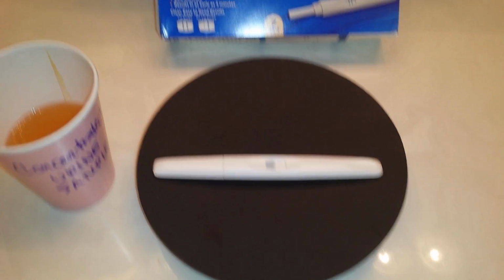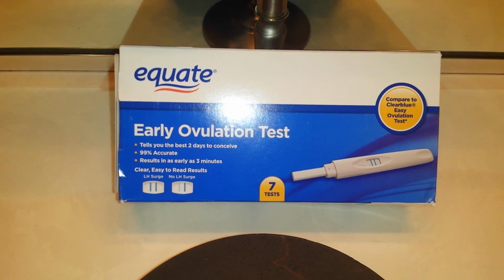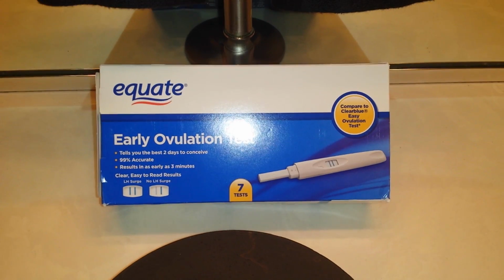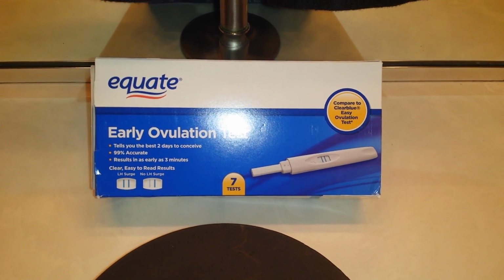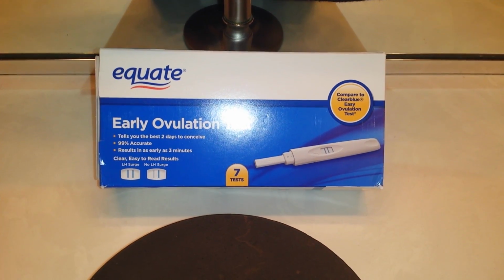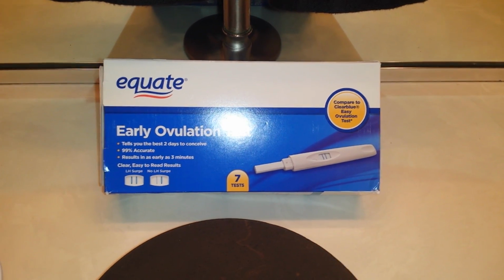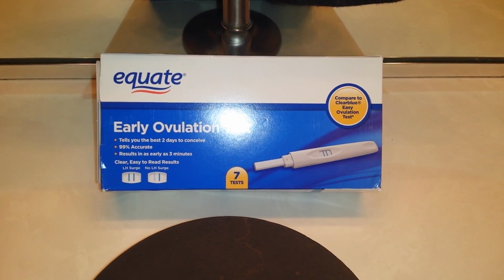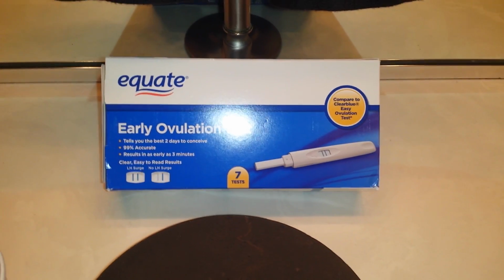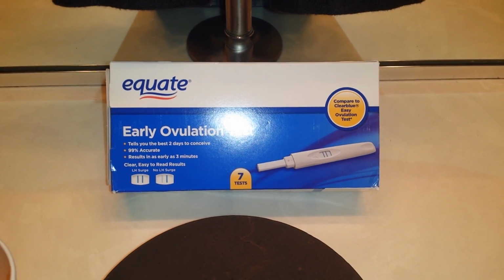For those of you who are new to using OPKs, the way it works, essentially, we have this luteinizing hormone that runs through our systems all the time. Just prior to ovulation, we get a surge. The surge is what's responsible for rupturing the egg, hence causing ovulation to occur. You can detect it with an OPK, followed by taking your basal body temperature for a temperature rise afterwards to confirm that ovulation did in fact occur, after a solid 3-hour block of sleep.